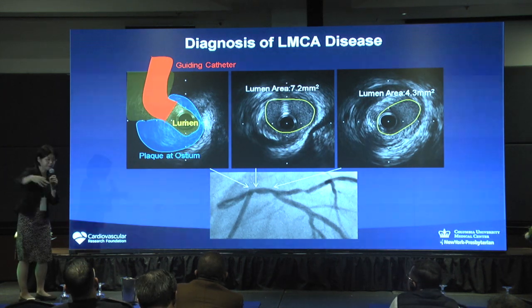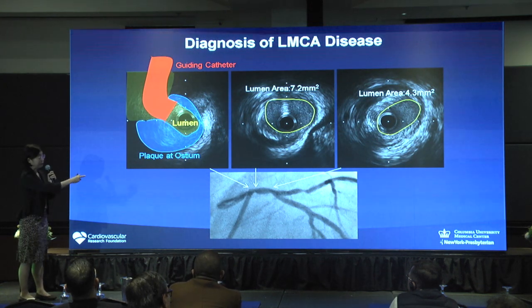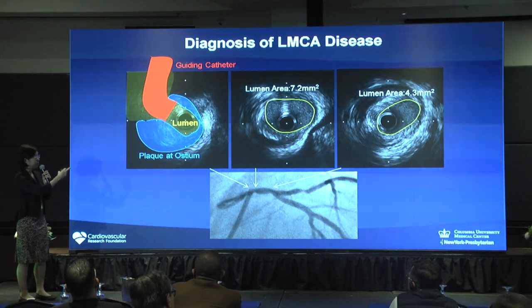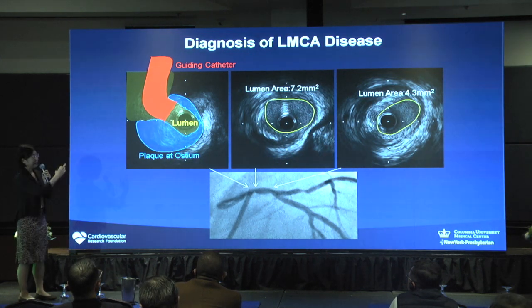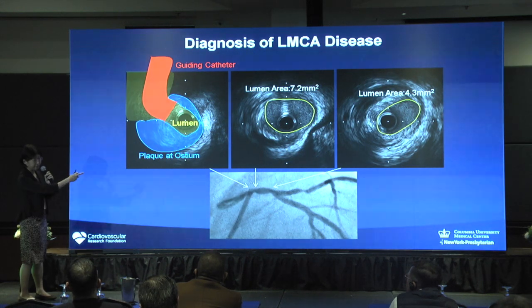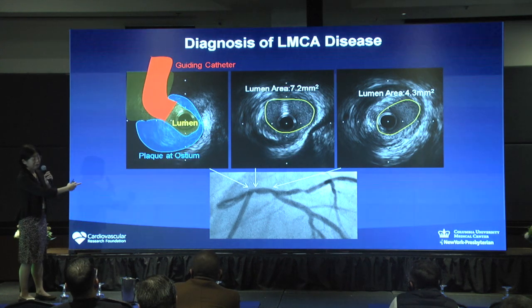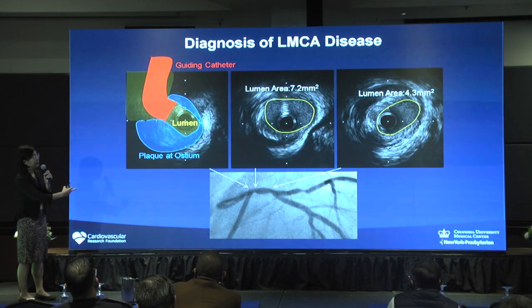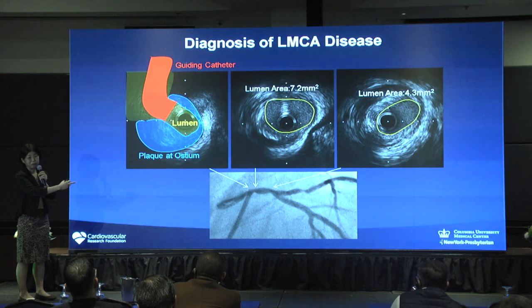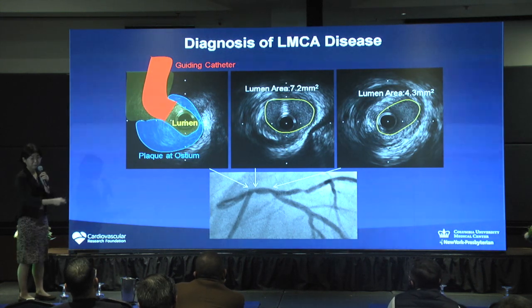So when we push the guide, you are actually almost making the stenosis with the guide. And angiographically it looks stenotic, and sometimes we see damping. But in this case, the most important stenosis is in the distal left main, not the ostium. But I do agree, when we treat this type of left main, putting the stent up to the ostium should be a good idea, because there is a chunk of plaque as well.